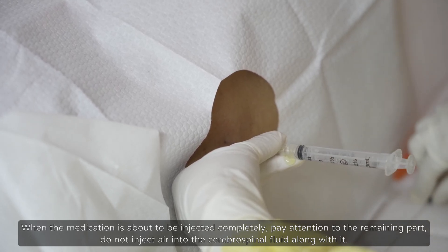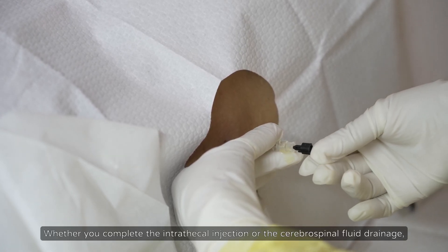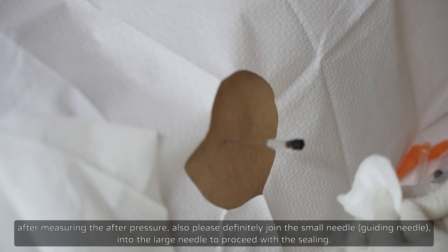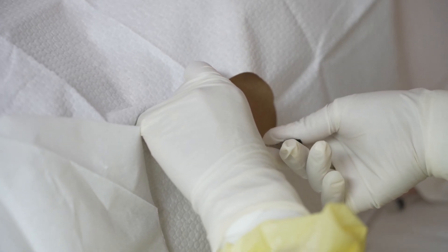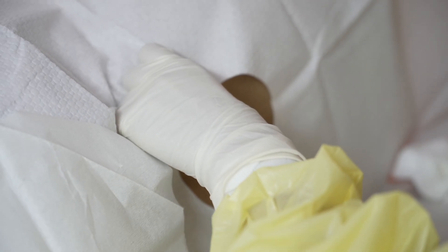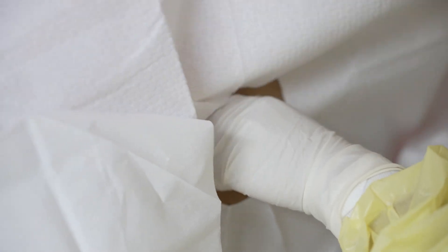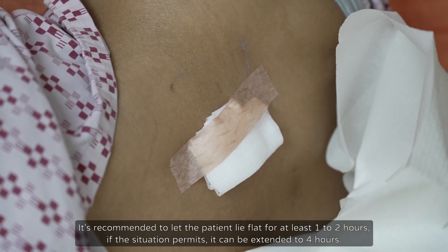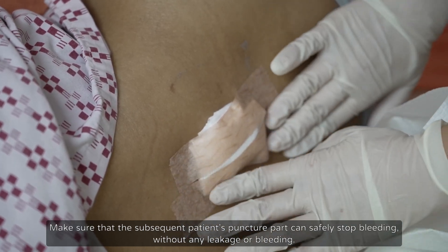When the medication is about to be injected completely, pay attention to the remaining part — do not inject air into the cerebrospinal fluid along with it. You can use a very slow speed: go forward two small divisions, pull back one, or go forward three pull back one, back and forth to push the medication. The goal is for the medication to gently and fully mix into the cerebrospinal fluid. Whether you complete the intrathecal injection or the cerebrospinal fluid drainage, after measuring the after pressure, please insert the small guiding needle back into the large needle to proceed with the sealing. Then carefully pull both the large needle and the guiding needle out. Cover it with a gauze and apply appropriate pressure to stop the bleeding. After completion, please let the patient lie flat. It's recommended to let the patient lie flat for at least one to two hours; if the situation permits, it can be extended to four hours. Make sure that the subsequent patient's puncture site can safely stop bleeding, without any leakage or bleeding.